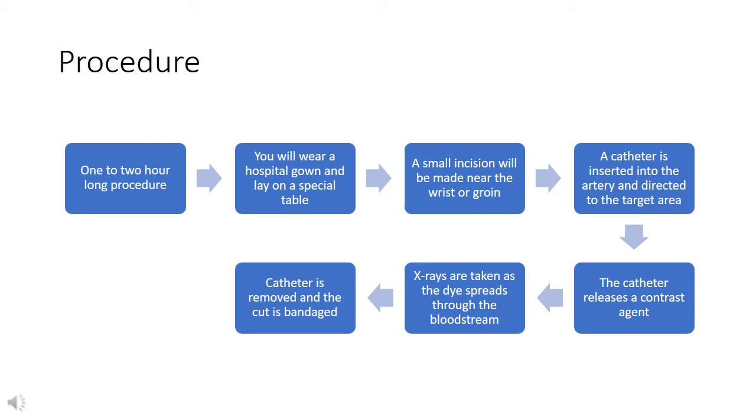It's carefully directed to the target area, and you may feel some tugging as this is done. However, it should not be painful. The catheter releases a special dye known as a contrast agent. You may feel a brief sensation of heat while this happens.